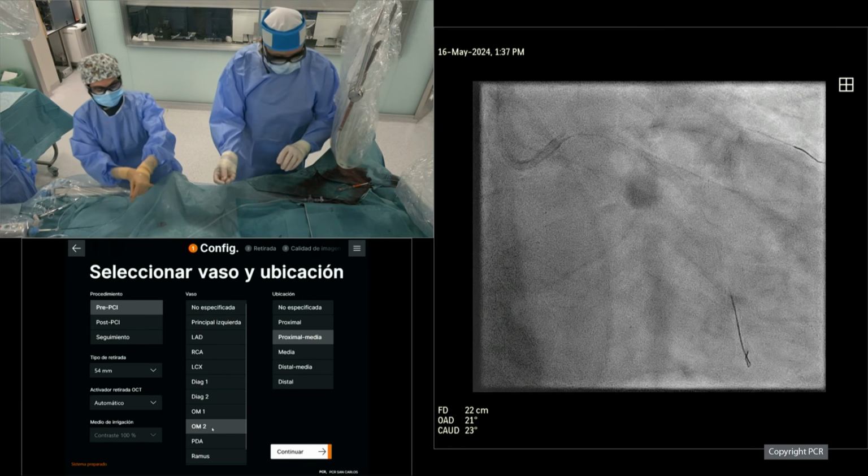So by the way, this OCT catheter is amazing. I think we have a cross here near us. Okay, we need to be careful with this. Can you hold the wire in this from there? Okay. It's amazing. I mean, you notice that this is the new generation of OCT wires and has the possibility of crossing in a much better way than previous generations. Yeah, it's a huge difference.